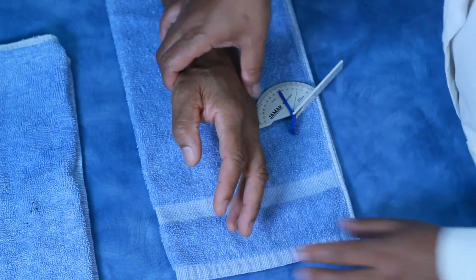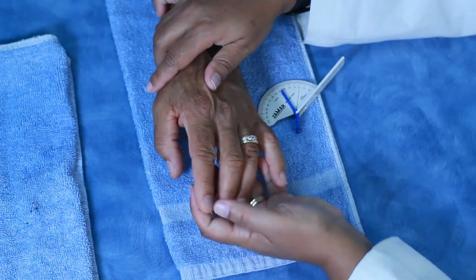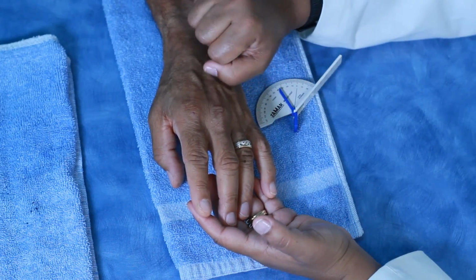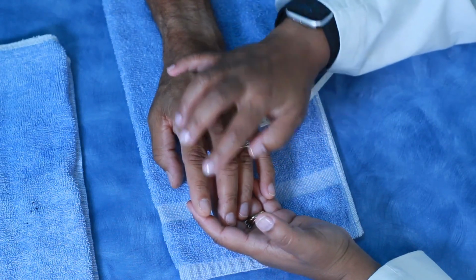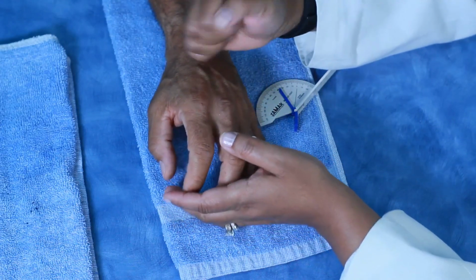So now what we're going to do in the same position, and I'll turn his hand like this, and what you will notice is for this particular endeavor, in order to get a composite fist, we must measure 12 measurements, 1, 2, 3, on 4 digits. So I'm going to ask him to make the best possible fist he can make.